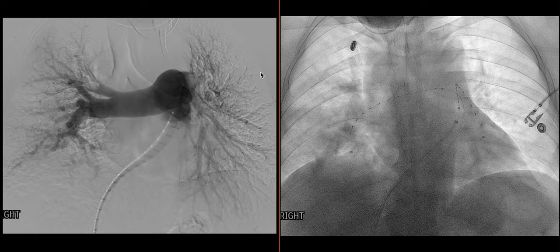This case serves as a follow-up for a CTPE study with a very high PE burden with signs of elevated right heart pressures, which ultimately required interventional radiology intervention for patient stability. That intervention is the study we're going over here.